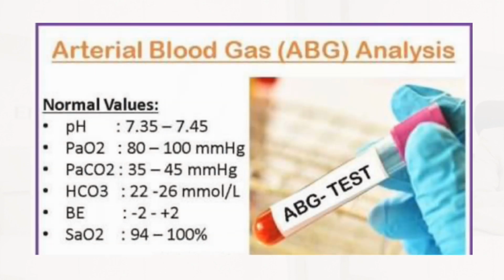Reference range is as follows. pH 7.35–7.45. Partial pressure of carbon dioxide, PaCO2, 4.7–6.0 kilopascals or 35.2–45 millimeters of mercury. Partial pressure of oxygen, PaO2, 11 to 13 kPa or 82.5–97.5 millimeters of mercury. Bicarbonate, HCO3, 22 to 26 mEq/L. Base excess, -2 to +2 mmol/L. Oxygen saturations as follows. 94–100%.